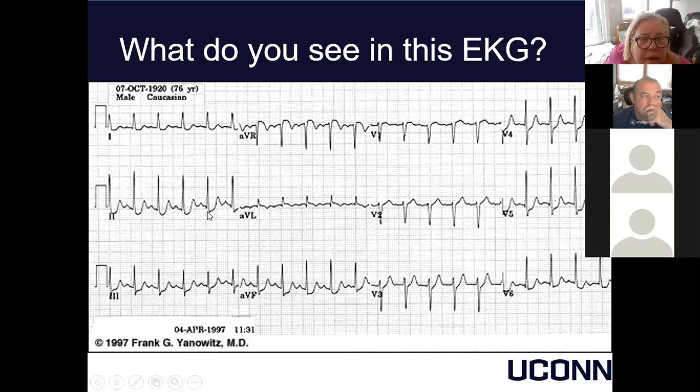Our QRS is narrow, probably 0.1 or so. And then we can start looking again at our baseline.